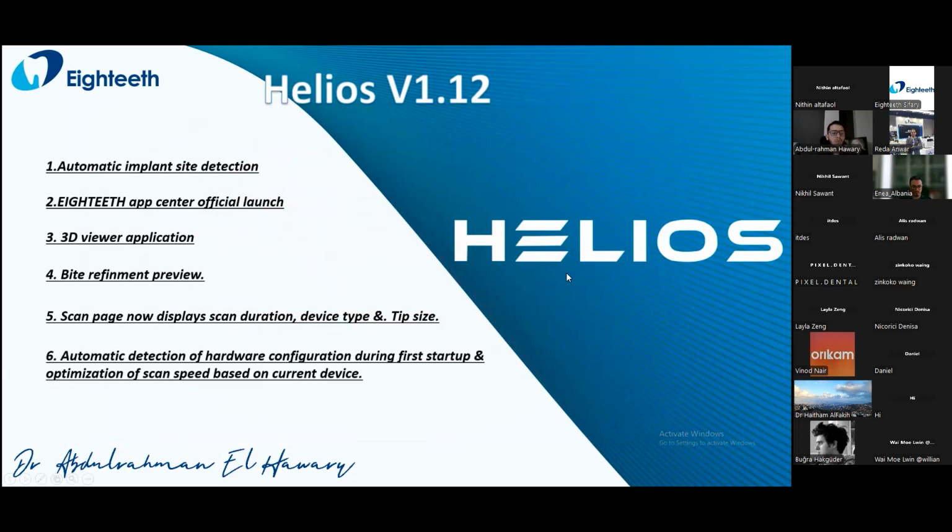Also, this one would be very beneficial for most dealers because most dealers do not supply their clients with laptops. They just supply their clients with the recommended specs and system requirements, and clients buy the laptop on their own. So sometimes dealers face the problem where they supply the minimum requirements, and the client buys something less than the minimum requirements or wants to try a laptop that he already has in his own clinic.